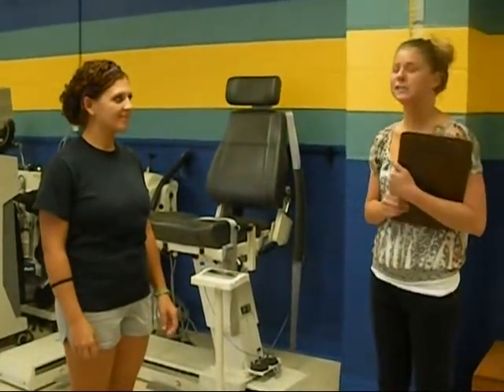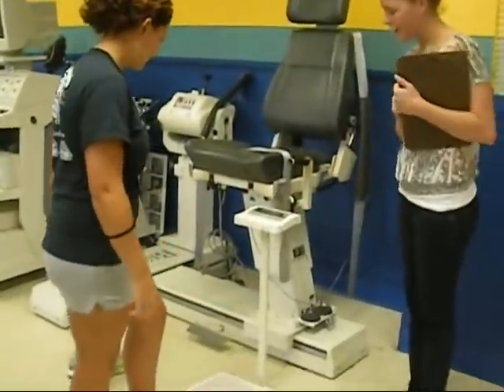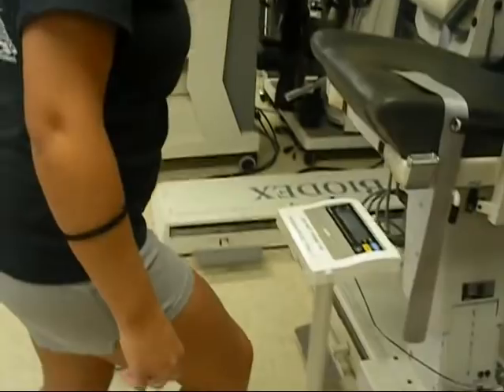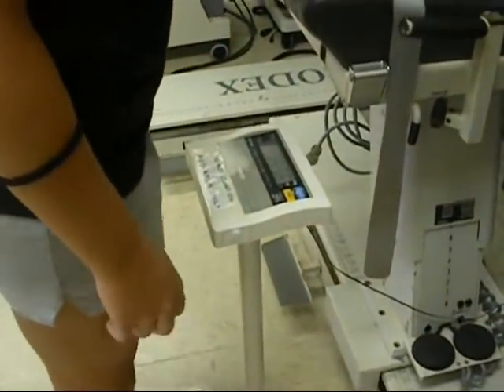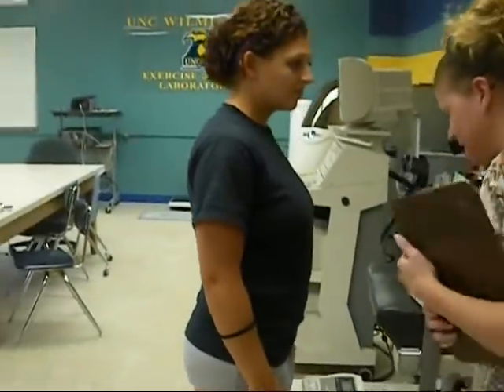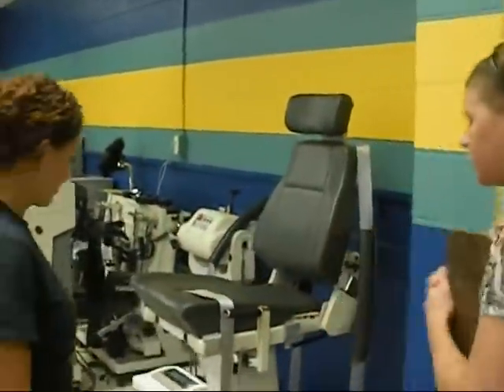Today we are calculating BMI, which is weight over height. We have a calibrated scale set on zero and she's going to step on and we'll take her weight. Make sure your shoes are off so results are more accurate. Her weight is 156.8 pounds.